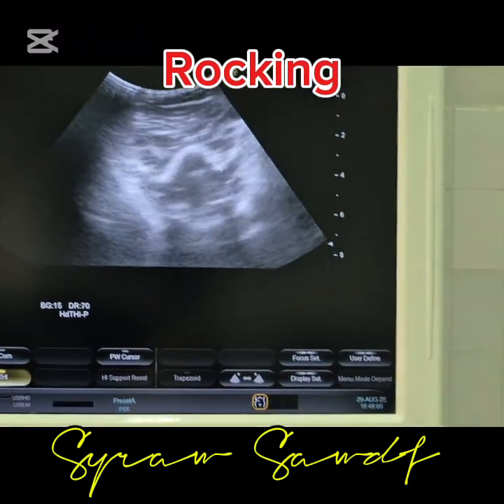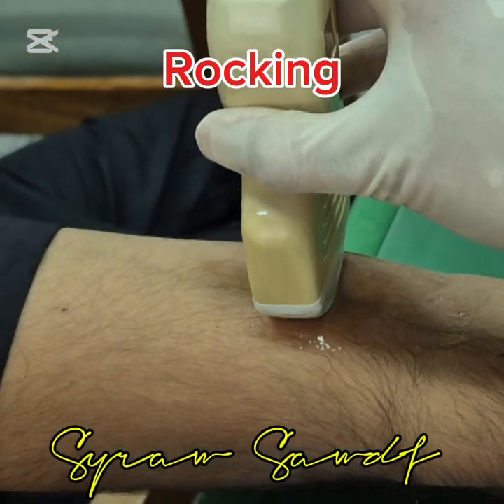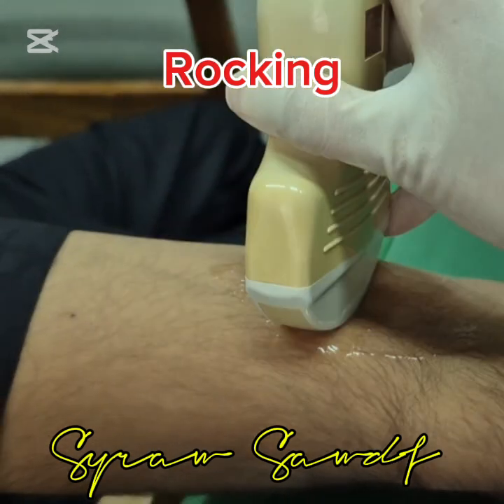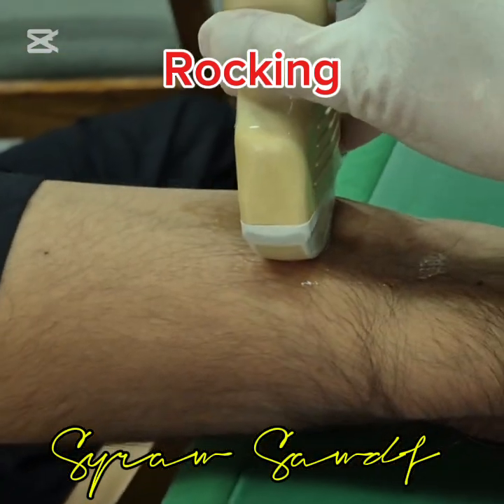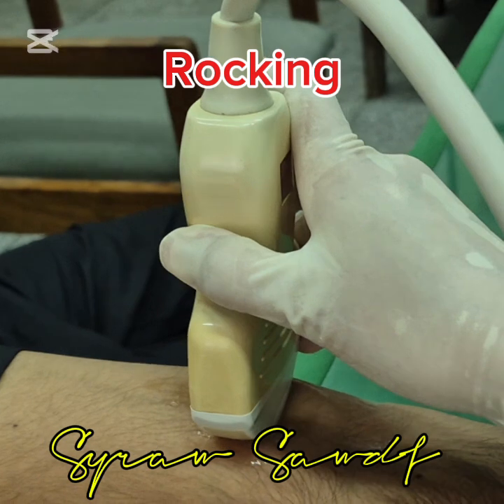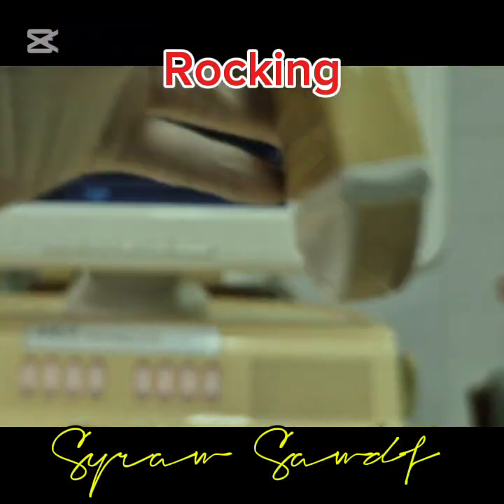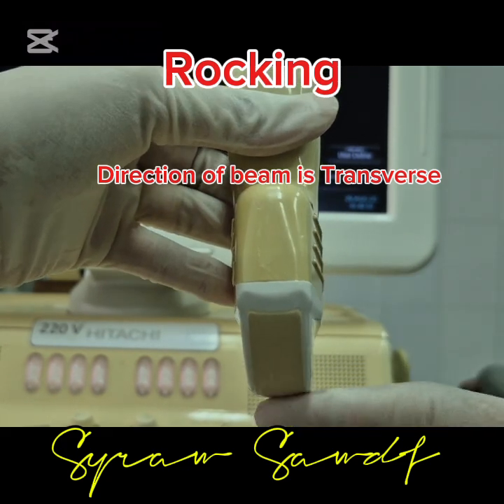Let me show you what is rocking. We keep the probe on the one place and we just rock it back and forth like this. Now what we are doing, actually this movement is performed parallel to the beam of the probe. Now this is the transverse axis of the beam, right?